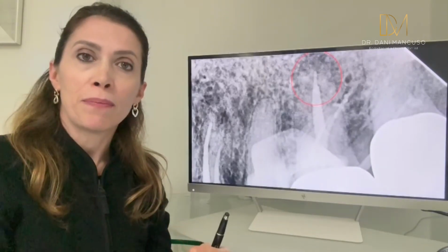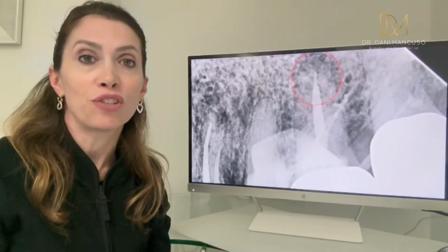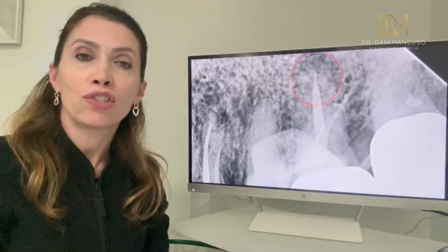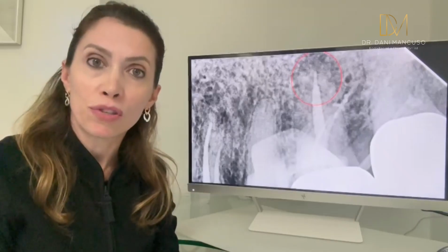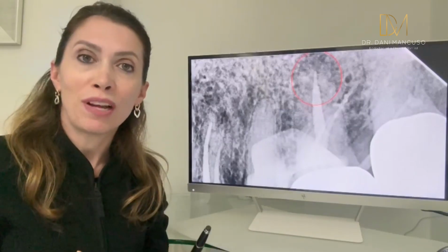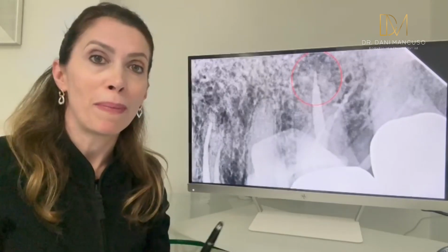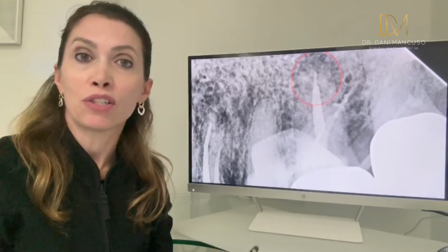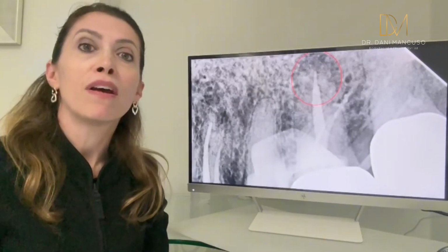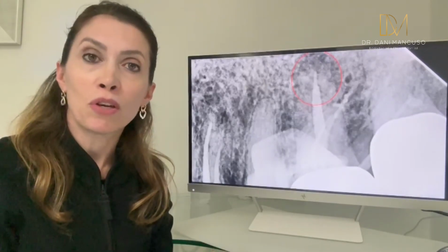When you put the GP in, make sure the GP doesn't go through the apex, because if it goes through the apex, it means that your GP is too thin for your prep. You need to go with one size larger than that and see if it still goes through. And if it goes short, you need to compensate as well. So you should have in your drawers more than one size, not just the matching GPs. If you have a system that finishes with 30 and that's your normal finishing size, you should have a 25 and a 40, for example, to compensate for the anatomy of that canal.